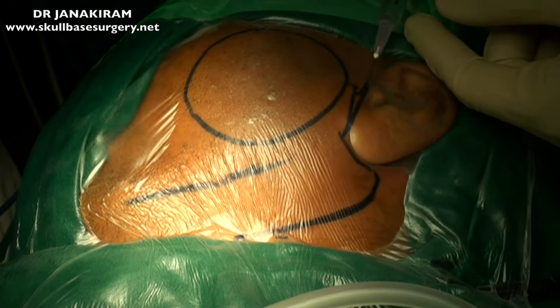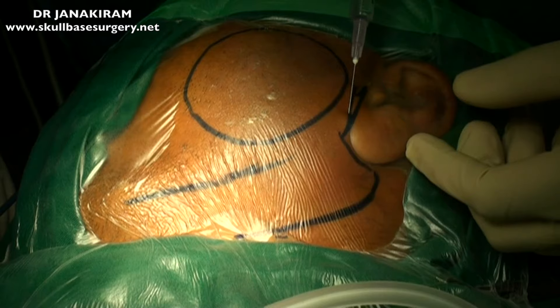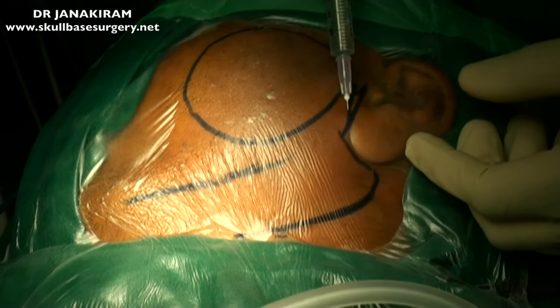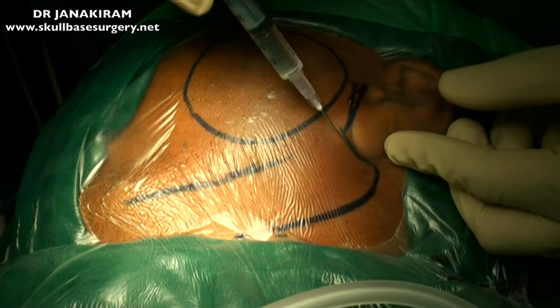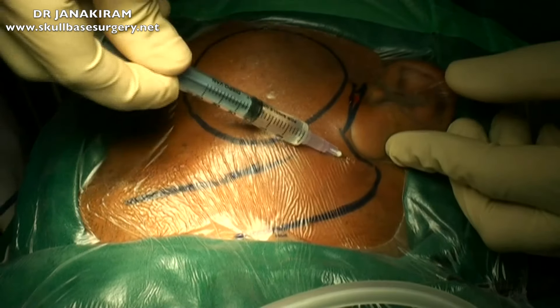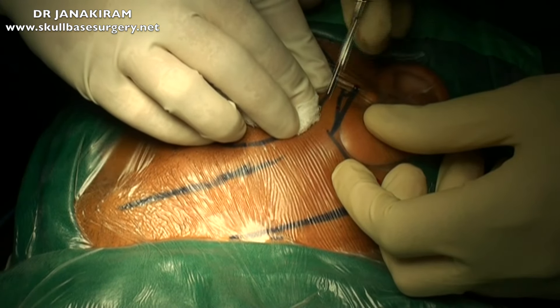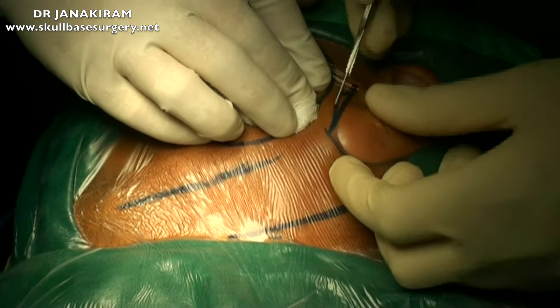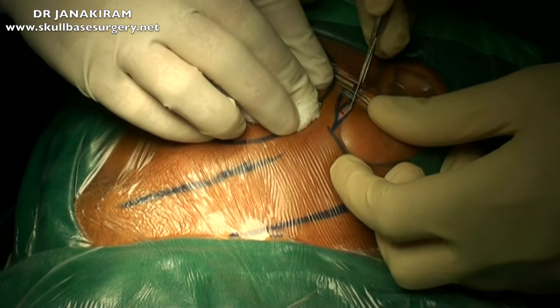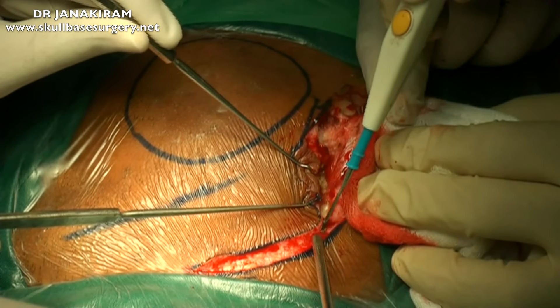That is the modified Blair's incision. Here the swelling was very large, so we had to use a slightly larger incision. Care is taken not to make the incision over the mastoid very acute, and that is the vertical limb of the incision being made.